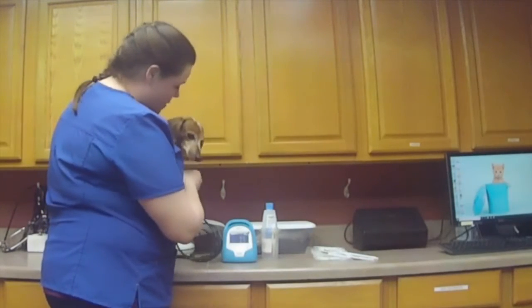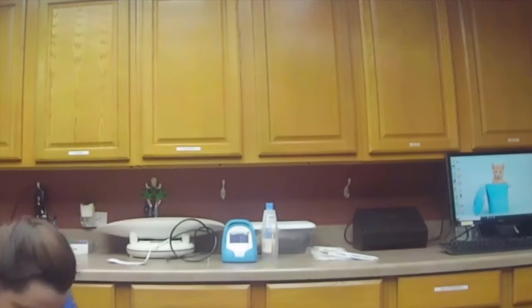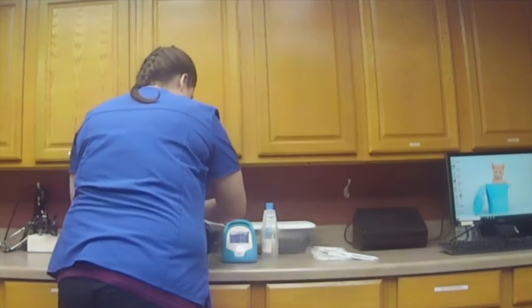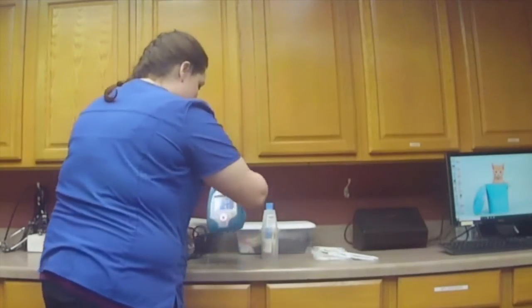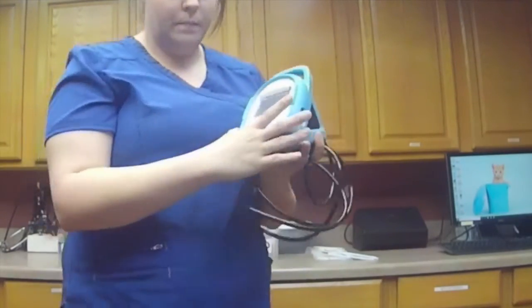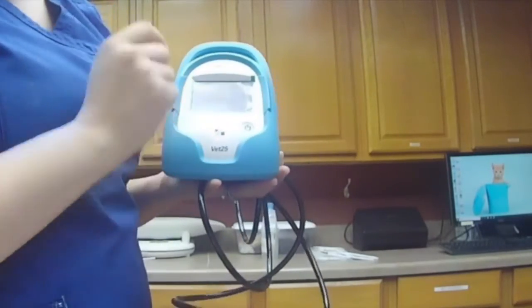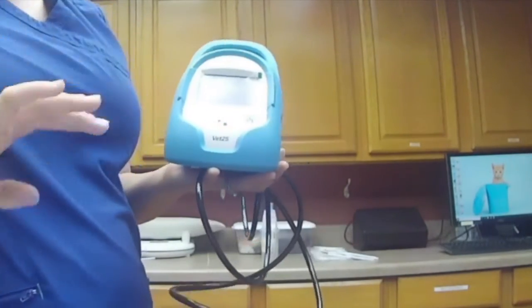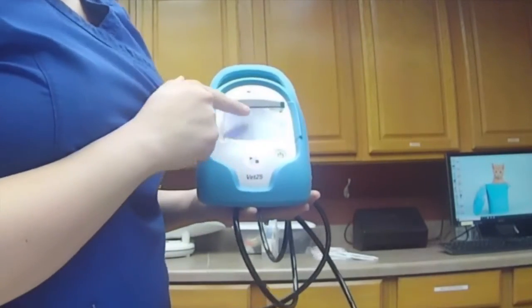I can let you on the floor. What you want to do is unwrap your patient, and I will show you the screen. And put this here. Perfect. So it's showing here, she has a 70 beats per minute heartbeat rate, so it's really low, but she is sleepy and it's kind of late. And this is her blood pressure.